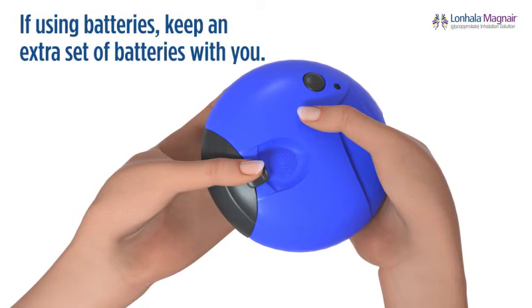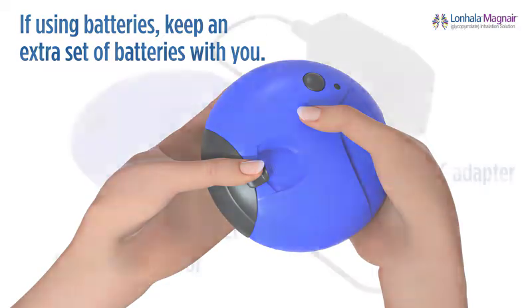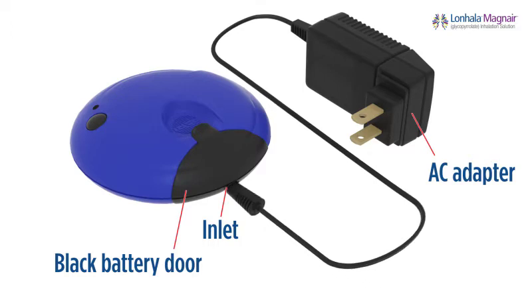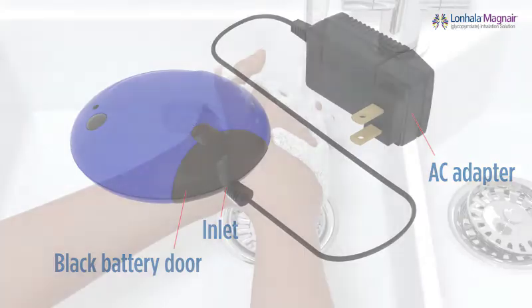If you choose to power your controller with batteries, make sure you have an extra set of batteries with you at all times. If you choose to power your Magnair with the AC adapter, plug one end of the AC adapter into the inlet on the black battery door of the controller and the other end into a wall outlet.